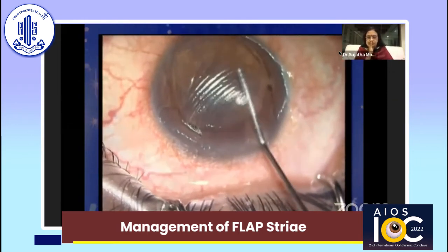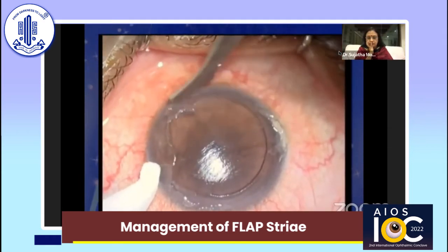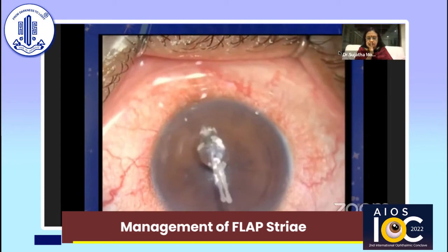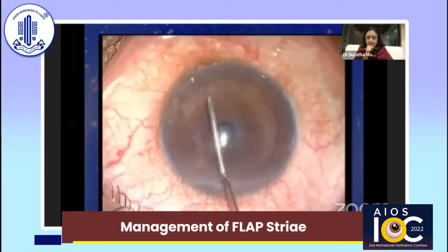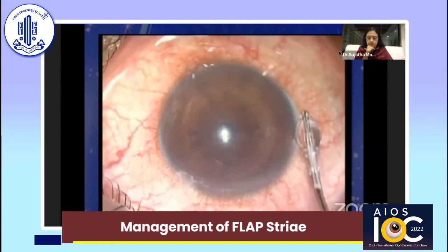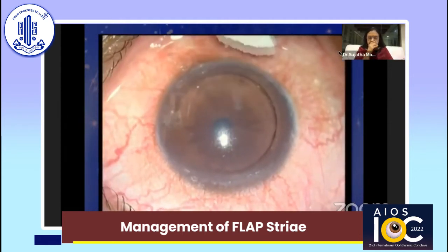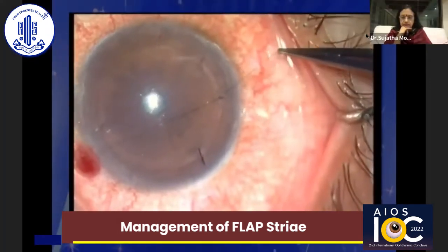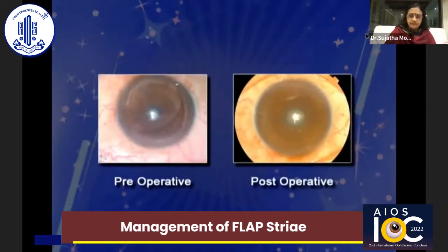The folds in the flap can best be addressed by removal of epithelium on the surface, so the epithelium is completely removed on the flap surface as well. The flap folds are stretched using two dry Merocel sponges. The bed is washed to remove epithelial nests, the flap is replaced and smoothened with a wet sponge. Four 11-0 nylon sutures and one 10-0 nylon suture were applied to keep the flap in position, then a bandage contact lens is placed. The post-operative picture shows a smooth flap with a good return of visual acuity.